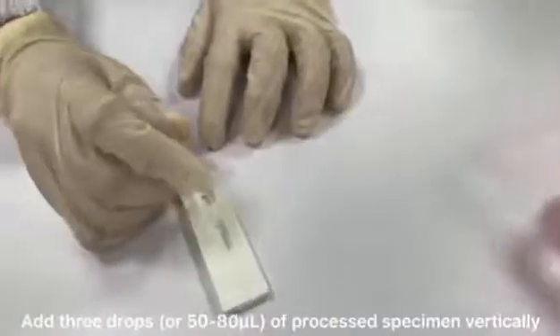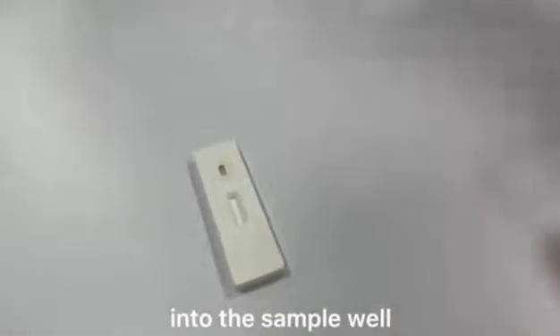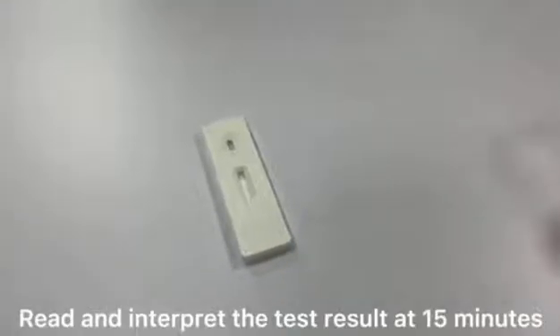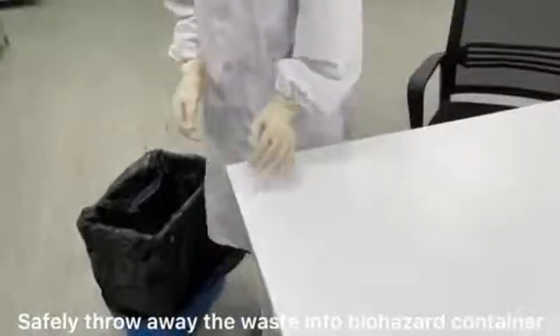Add 3 drops, or 50 microliters, of processed specimen vertically into the sample well. Then let stand for 15 minutes. Read and interpret the test result at 15 minutes. Safely throw away the waste into a biohazard container.